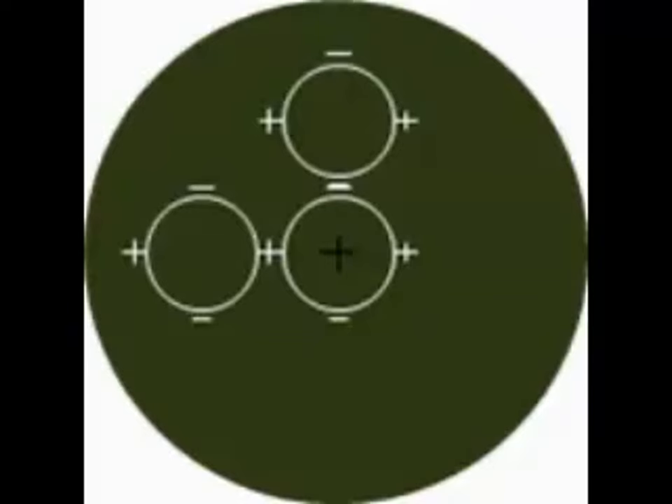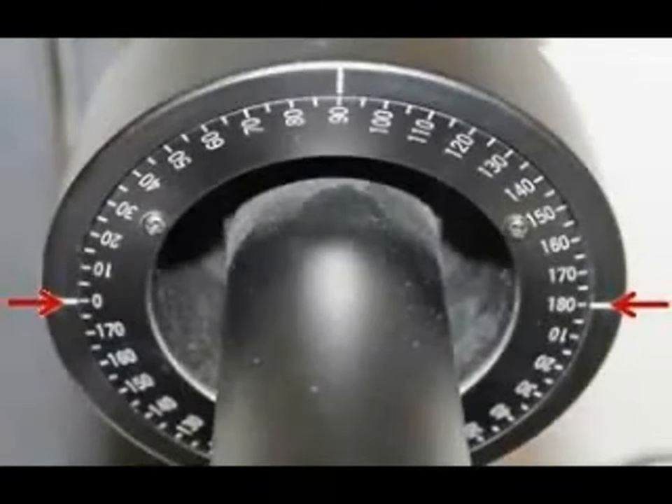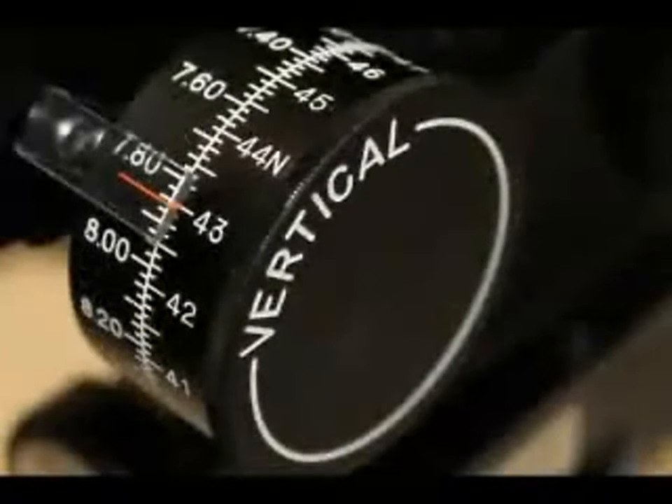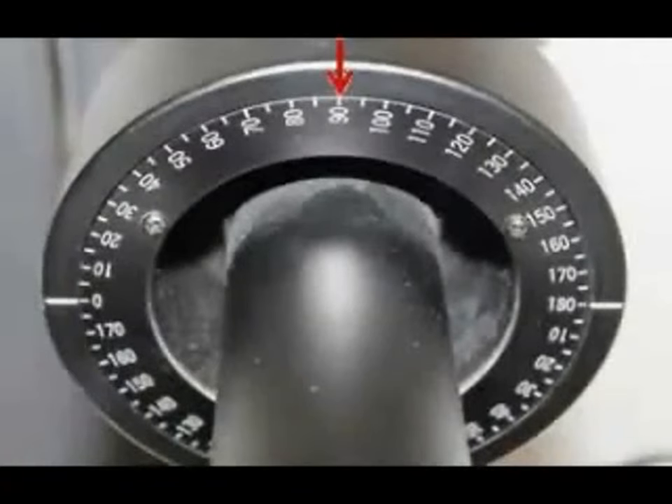Now follow these same steps for the left eye. The scale of the horizontal measuring drum indicates the dioptric power of the cornea along the horizontal meridian. The meridian indicators on the axis scale are white lines. Horizontal axes fall plus or minus 20 degrees around 180. The scale of the vertical measuring drum indicates the dioptric power of the cornea along the vertical meridian. Vertical axes fall plus or minus 20 degrees around 90.